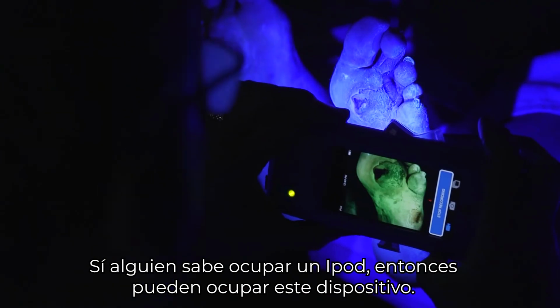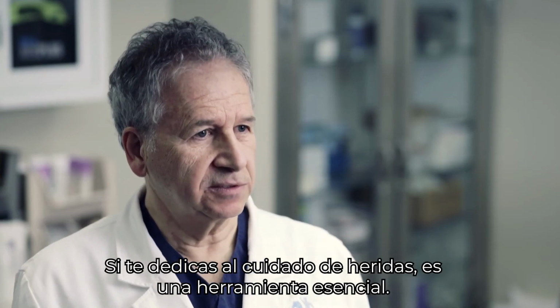If anyone can use an iPod, they can use this device. If you're involved in wound care, this is an essential tool.